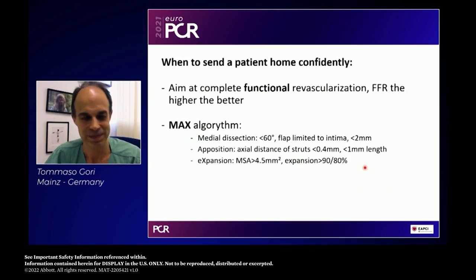Thank you very much. Great, Tomaso. Thanks. Again, we see that the decision whether or not to embark on revascularization is a functional matter, and FFR has been established as the gold standard thereof. And now, as we see, it can also be used as a prognostic tool and important quality control of our result. I have a number of questions, but as far as I know, there are good and important questions arising from the audience. So, Emanuele, could you please share that with us?